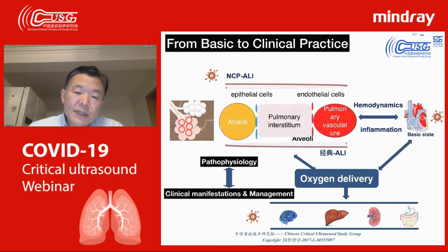If the patient is in a very stressed condition, with very deep, strong breathing, we will see the pressure inside the pleural space is very low in the inspiratory phase.